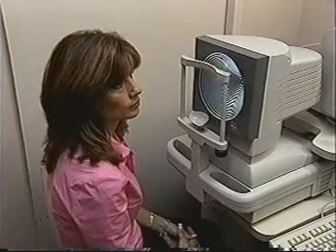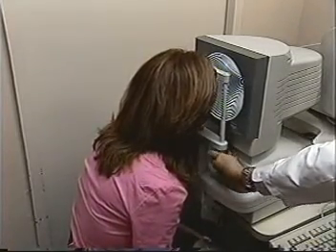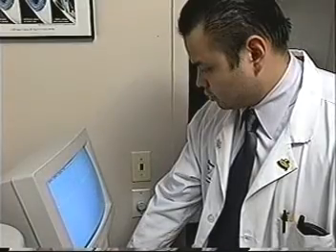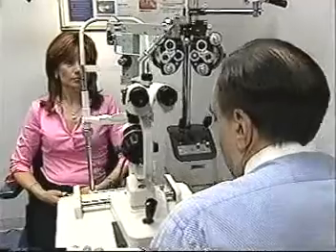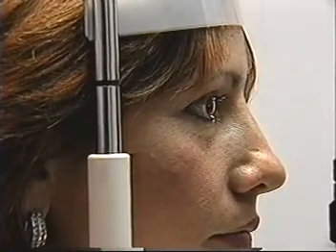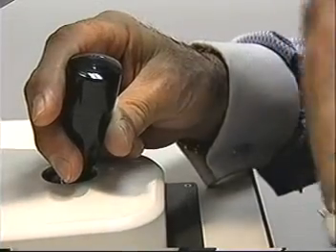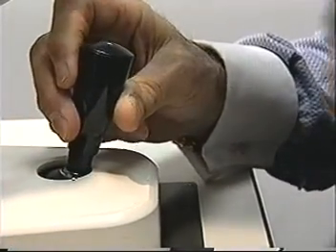Okay? This particular test is called corneal topography, or mapping of the natural contours of the eye. It's particularly important for us prior to surgery, basically to rule out diseased corneas, corneas that are misshapen. And that's what we're going to be doing right now. Michael's going to be doing this test on each eye. Good. Perfect. To have the surgery, your eyes have to be totally healthy, right? Now we know from the maps that we measured before that your eyes have a normal shape. We have to make sure that your eyes are very healthy this way here. Your cornea looks very nice and healthy. Your lids look good. The white part of your eye looks fine. Okay, no disease. Your eyes are very healthy.